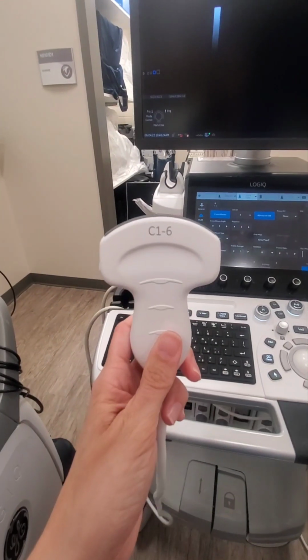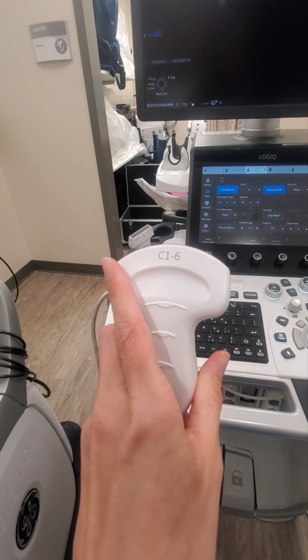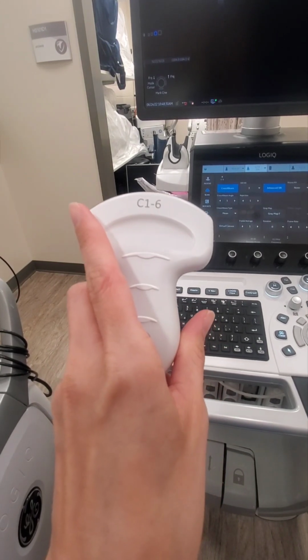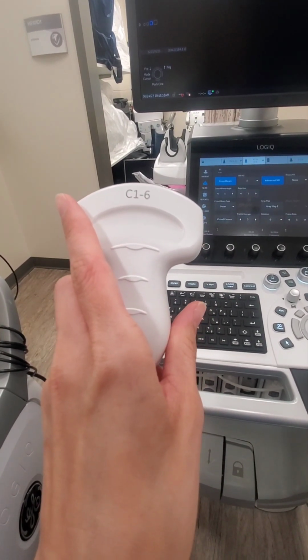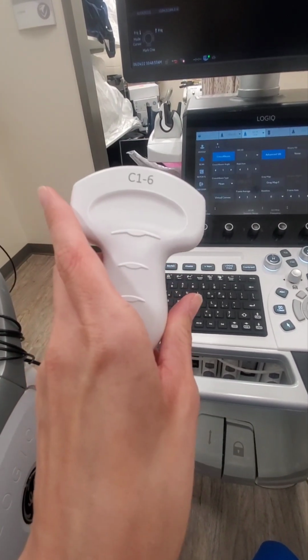But in general, a curved transducer is going to be lower frequency. It's going to have a wider footprint. It's going to be for deeper scanning, such as abdomen scanning, when you need to scan further into the body, okay?